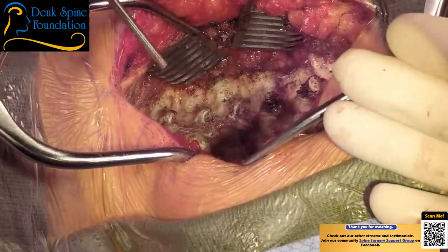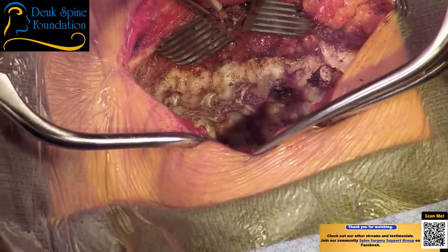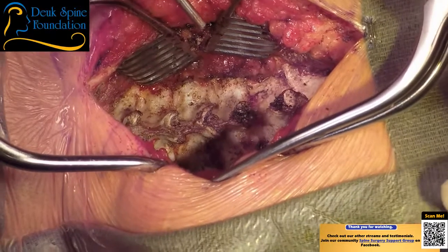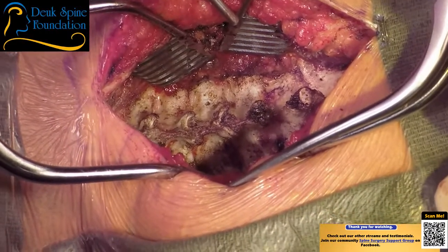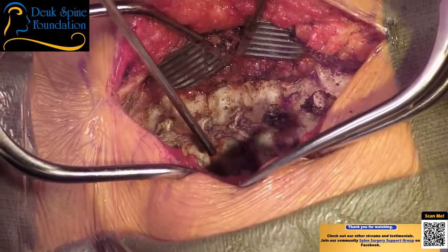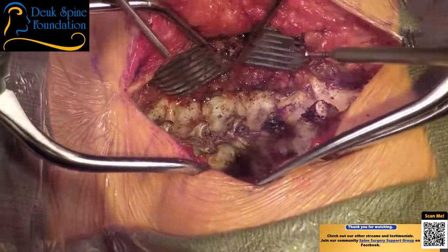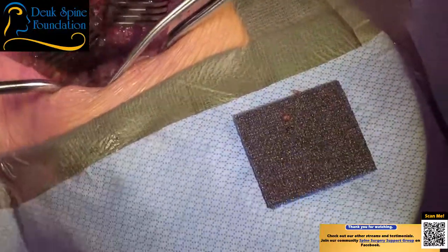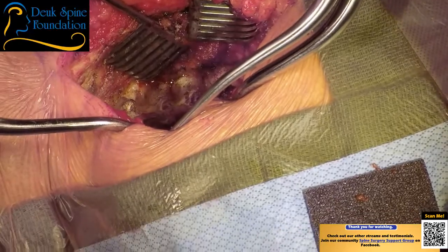A lot of surgeons come to this point, they get the bone out, and they throw it away, okay? And then they use bone graft, what's called DBM, allograft. But I believe autograft is probably the best bone you can put back in a patient to promote fusion. So I do a combination of allograft and autograft, the DBM allograft and the patient's autograft, especially when they have really healthy bone. Her bone looks super healthy to me. So she's gonna have nice diploic bone full of stem cells and scaffolding.